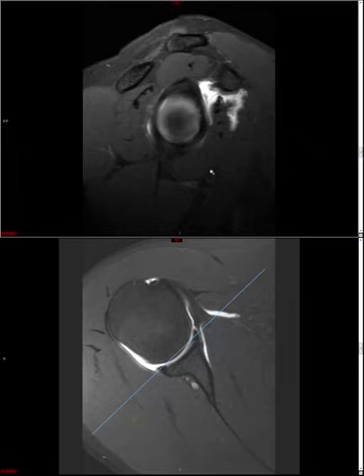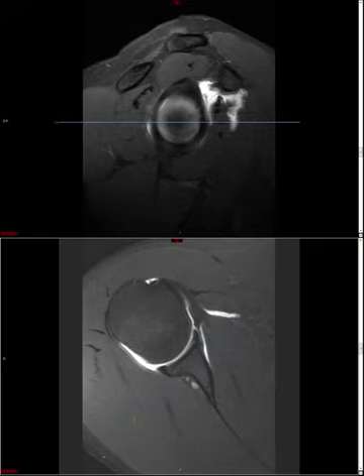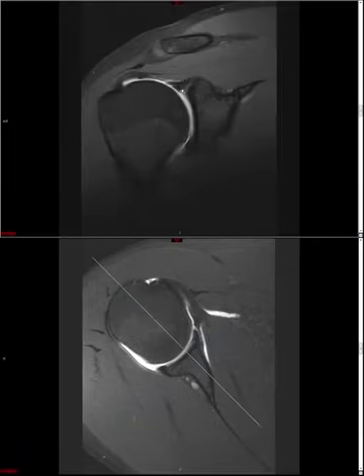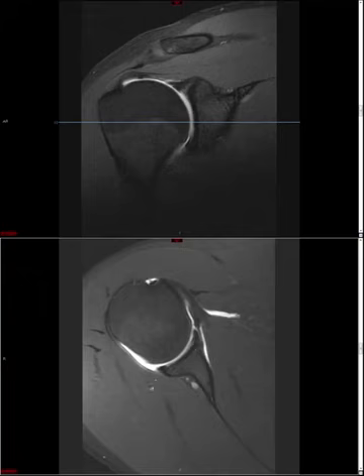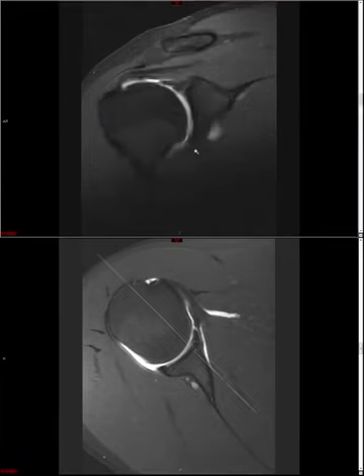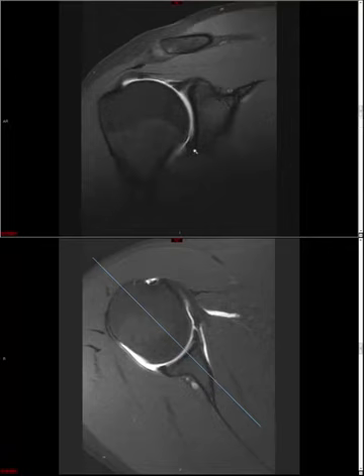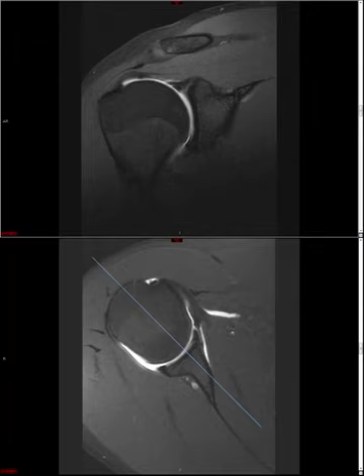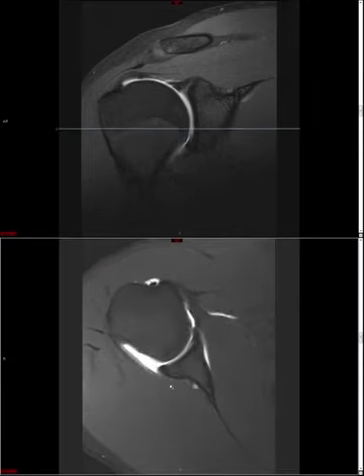The glenoid labrum is somewhat analogous to the knee meniscus — a fibrocartilaginous structure designed to deepen the glenoid and provide stability to the inherently unstable glenohumeral articulation. We generally use the coronal to look at the superior labrum and the axial to look at the anterior and posterior labrum, and the coronal for the inferior labrum as well. Normally, the labrum should be triangular in morphology and homogeneous low signal. The posterior labrum can have a rounded contour, which can also be normal.